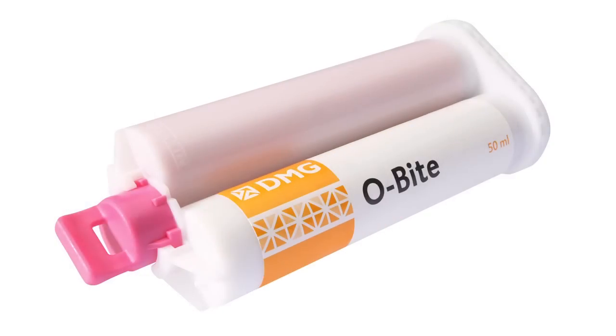I'm now going to use Obite and one of these bender brushes to record the stick bite. I'm going to squirt some Obite onto the occlusal surfaces, just the front of the lower teeth — a fair bit.